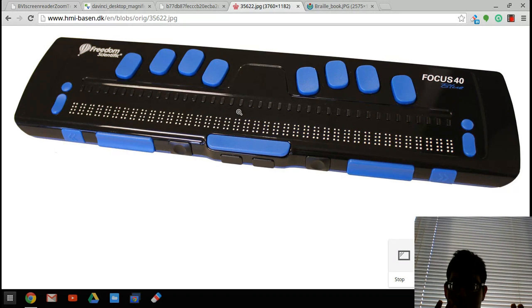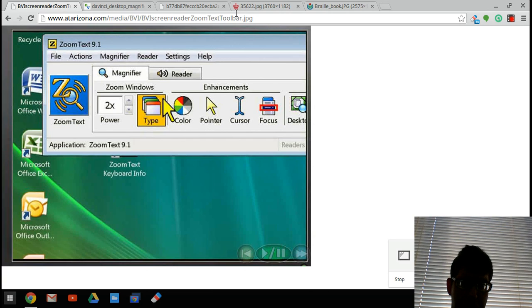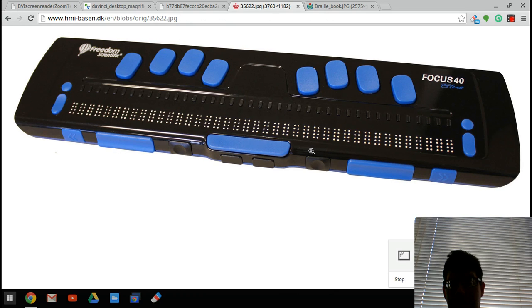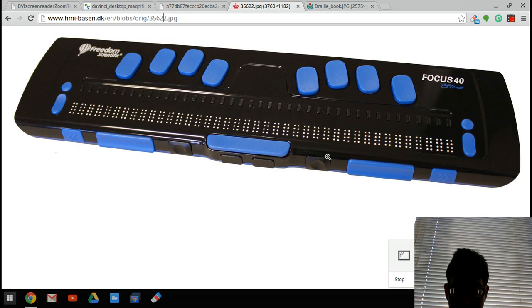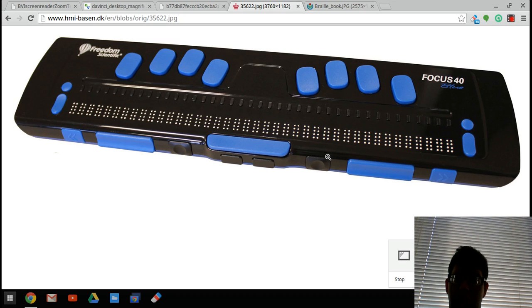If this technology is make it or break it for people with vision loss, whether it be partial sight with software and hardware, or no usable sight to the effect of being able to read print and thus needing to use Braille, or perhaps using Braille as a supplement. If you have an eye condition where your eyes get tired easily, say after 4 hours of computer work, but you have to stay on the job for 4 more hours, you could switch over to refreshable Braille.